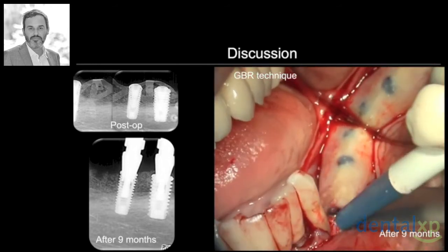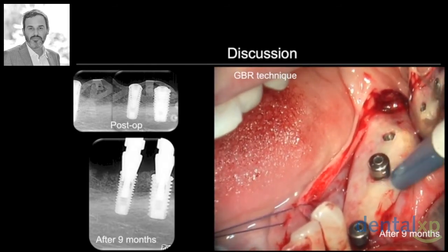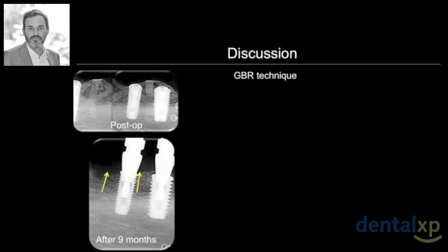But when you show videos with nice surgeries, you must always ask, how stable will this bone be over time? Because the real problem is long-term stability after vertical bone augmentation, in particular in the posterior mandible. 9 months later, on reopening, and we position the provisional prosthesis.